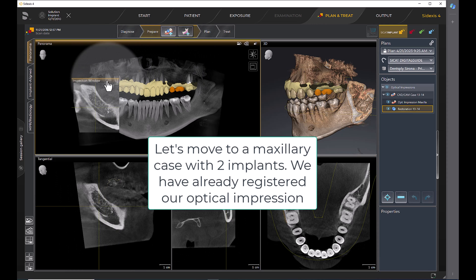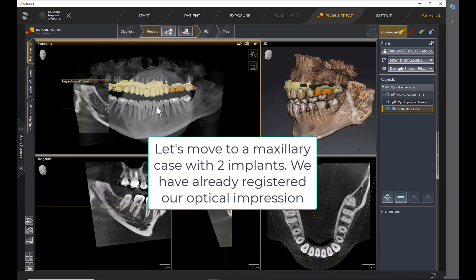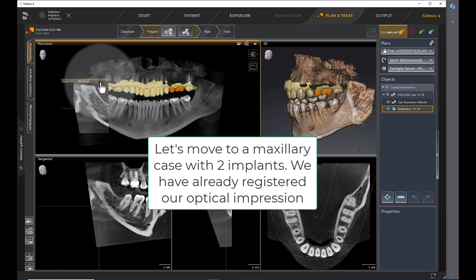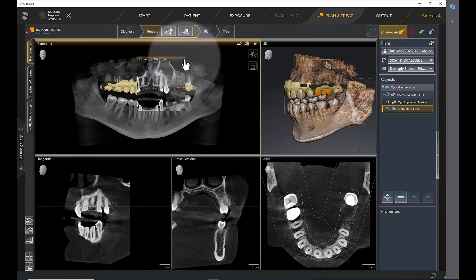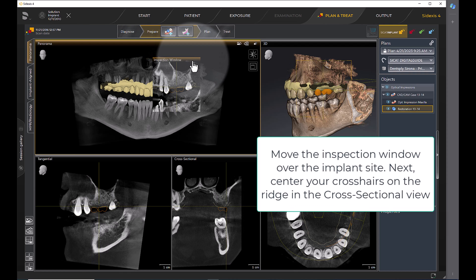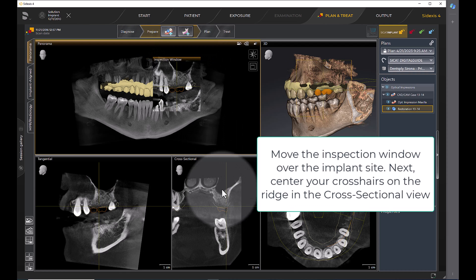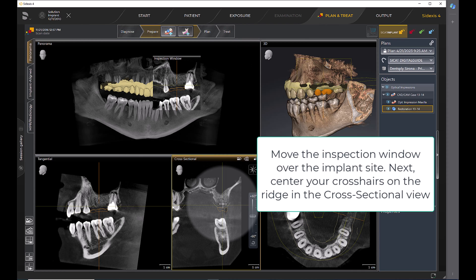Let's move to a maxillary case with two implants. We have already registered our optical impression. Move the inspection window over the implant sites. Next, center your crosshairs on the ridge in the cross-sectional view.